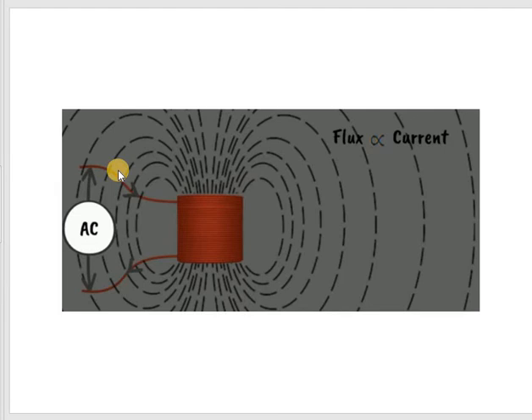The magnetization due to the current flow in the primary coil runs through the ring, or the iron core, and induces electron movement and current flow in the second coil. There is no electrical connection between these 2 coils. They are connected only by the magnetic field in the iron core.